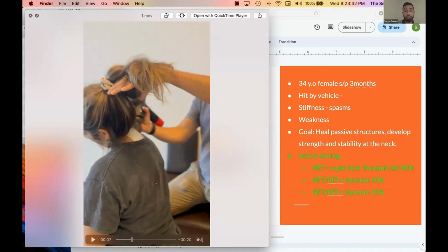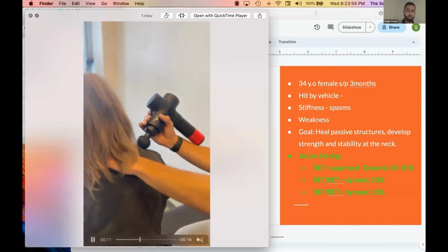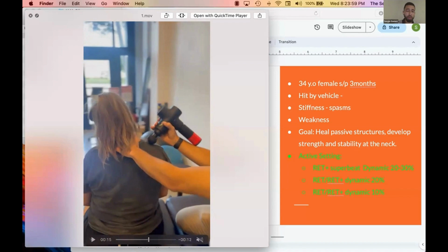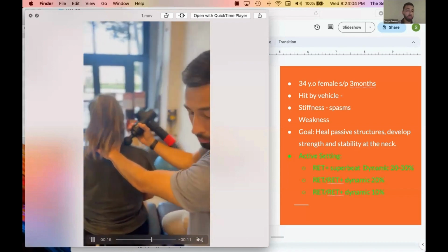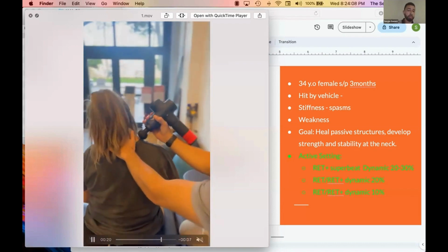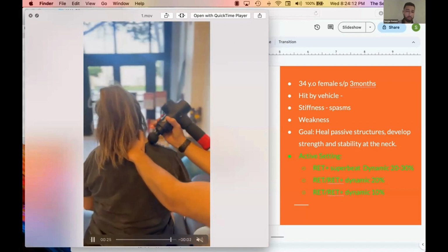And then I have another sticky pad underneath her shirt, right at the thoracic spine. So they're relatively close to each other. At 20-30%, you can get some heat generating pretty quickly because they're close by. Nothing too fancy here, just doing a little low frequency percussion, trying to bring down some muscle tone in conjunction with an active motion. It's a very gentle treatment, trying to treat the spasm.